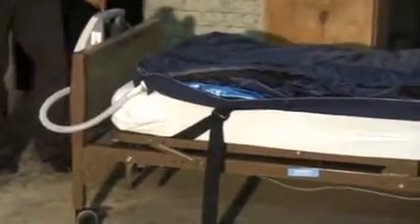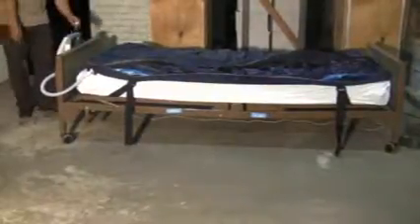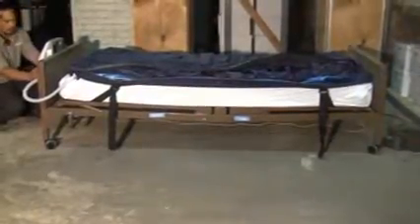You do have a power cord which should go underneath the bed frame towards the head section, towards a power outlet. The outlet does need to be grounded for proper electrical and safety function. Always ensure that the power cord is firmly connected to the side of your air unit in the power receptacle.